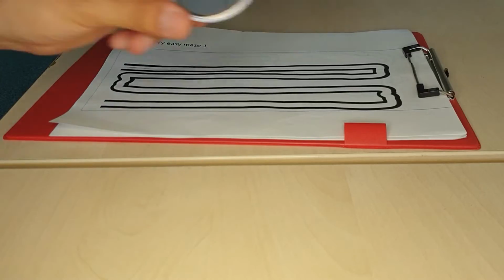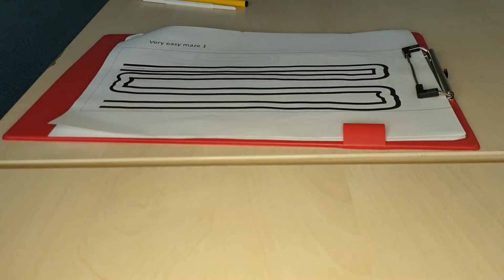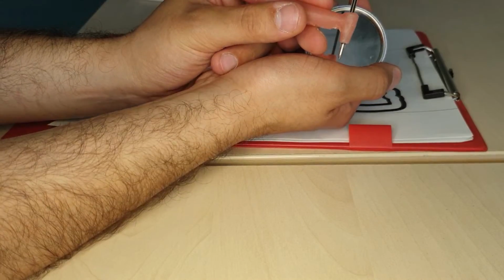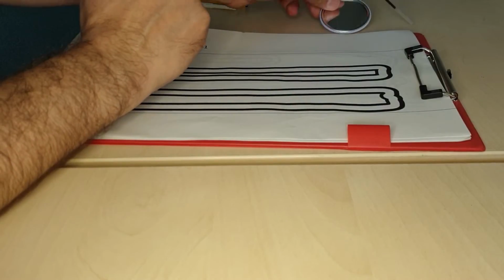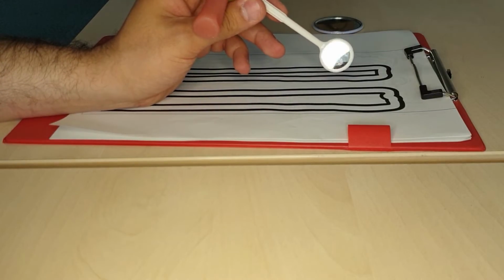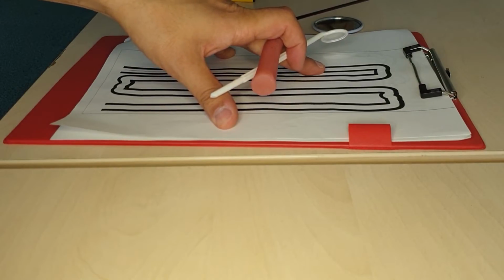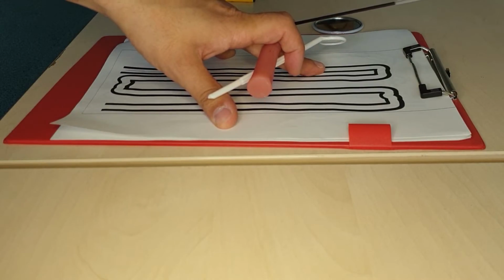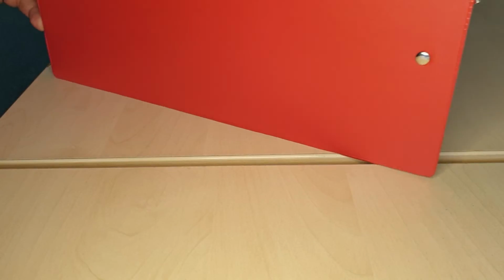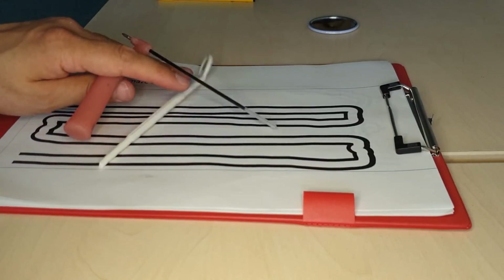One of the ways we do this is by introducing mirrors. And for these, students will use the maze with indirect vision using this mirror here. We can decrease the size of the mirror to make it more complex using a standard mouth mirror. For these exercises, the maze is normally orientated in front of the student so that they can only see this through direct vision and must use the mirror in order to navigate the maze.